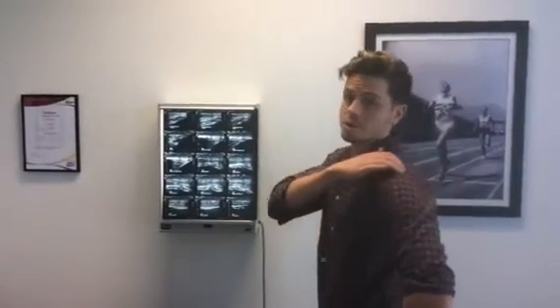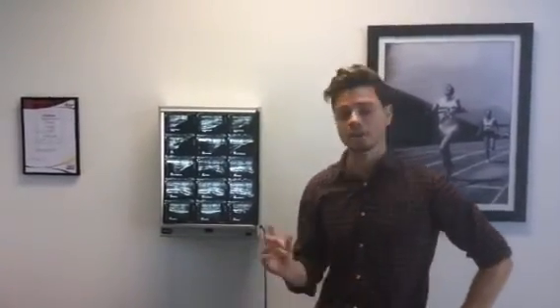But they're also good at looking at tears, so whether or not you've got, like, a rotator cuff tear, and it can determine whether it's a full thickness or partial thickness tear. So they're really good at identifying those things. And thirdly, they're really useful for tendons to see how they're actually behaving when you move. So you can have a look at a joint and move the joint, and then you can see the tendons moving and sliding the way they should. So real time, dynamic assessments.